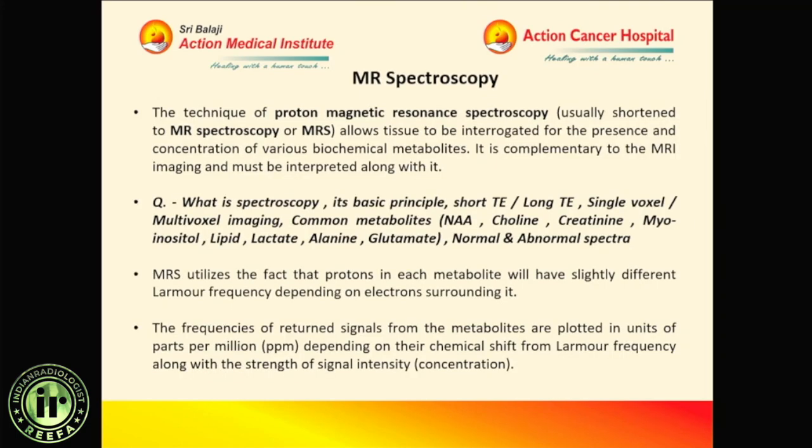So MR spectroscopy, the technique of proton magnetic resonance spectroscopy, usually shortened to MRS, allows tissue to be interrogated for the presence and concentration of various biochemical metabolites. Now it is complementary to the MRI imaging and must be interpreted along with it. So today our target is to answer this question at the end of this session.